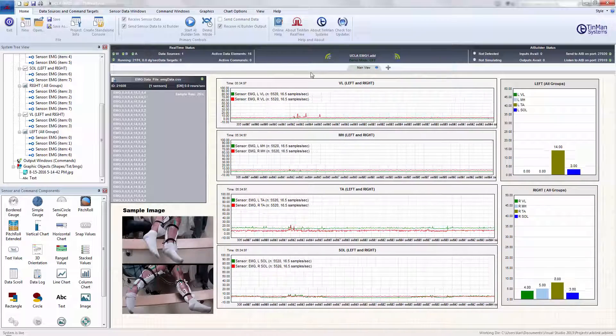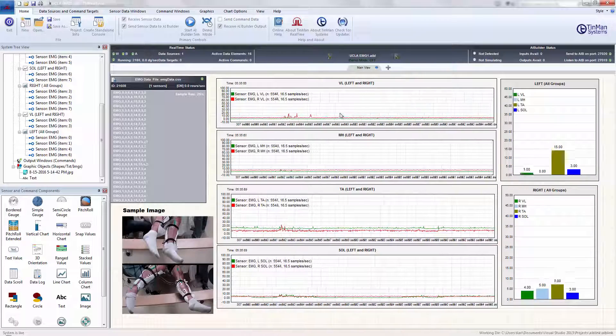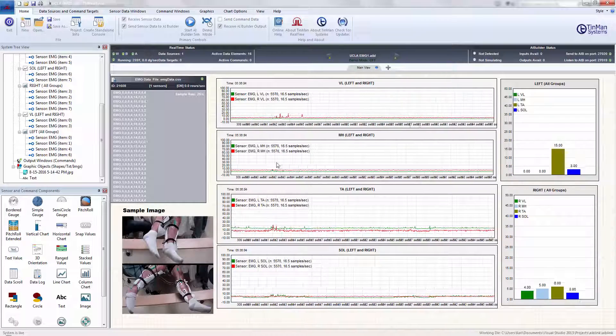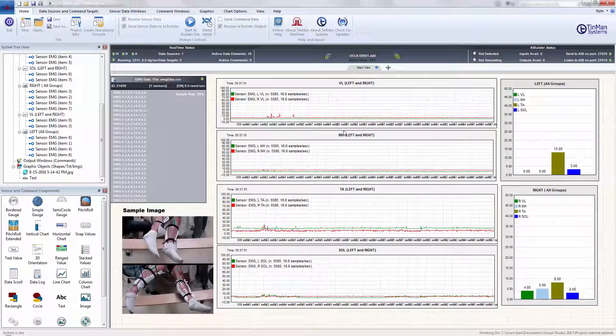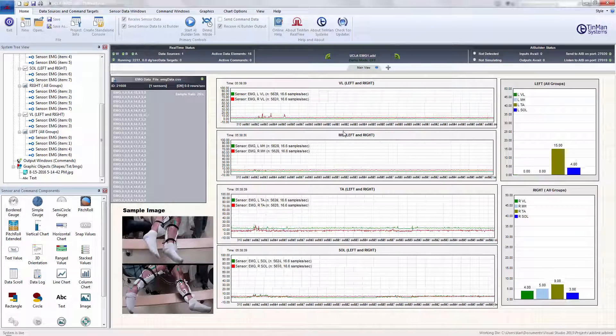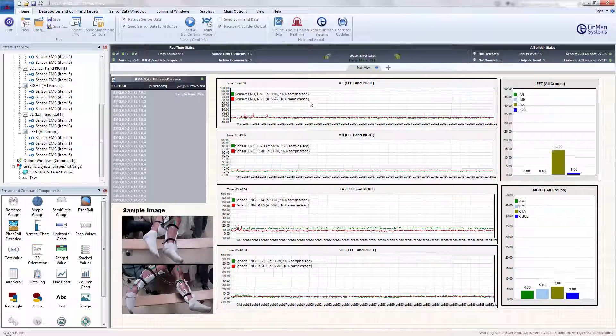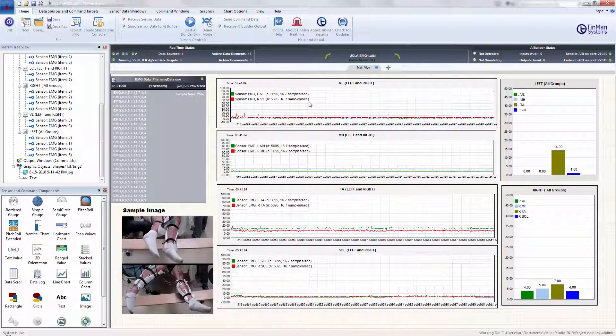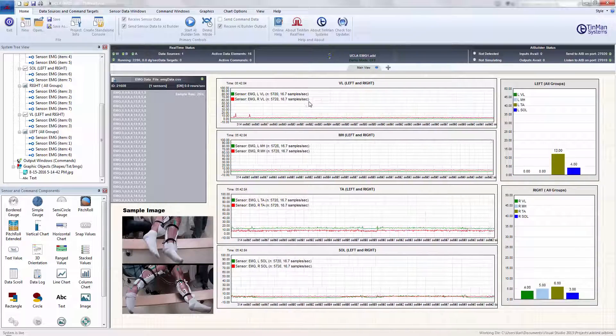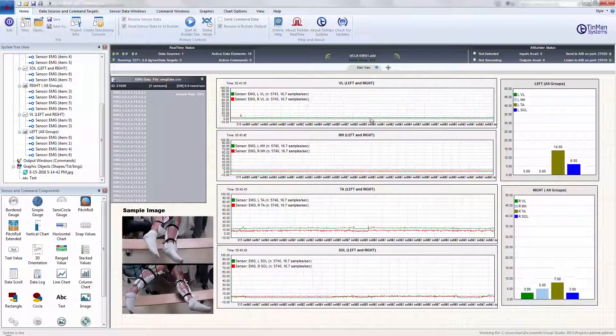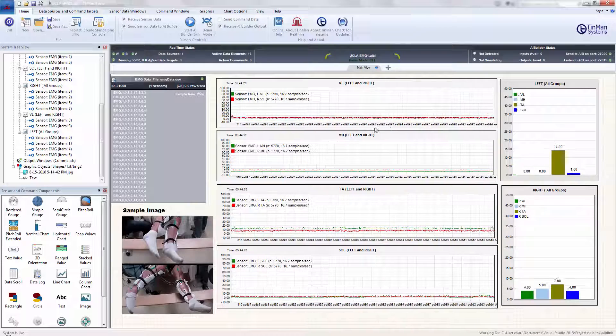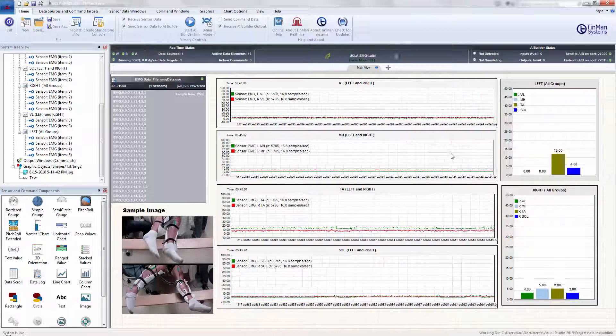Anyway, this would go on theoretically for eight hours. So what we're doing here is just essentially reliving at the same rate the EMG activity of this particular patient.